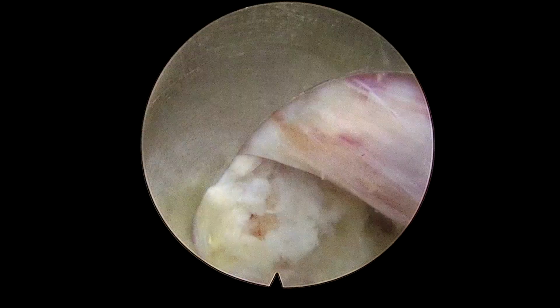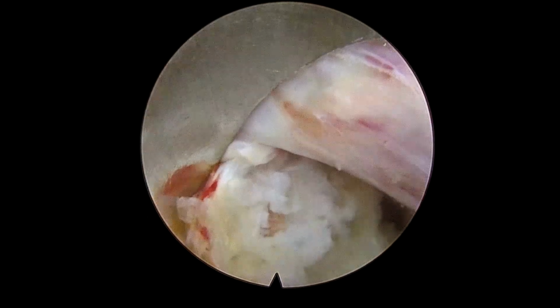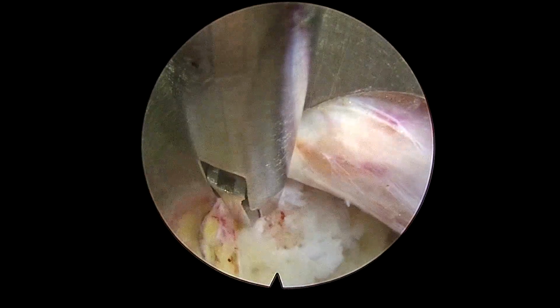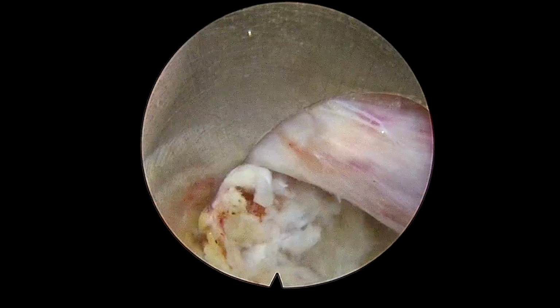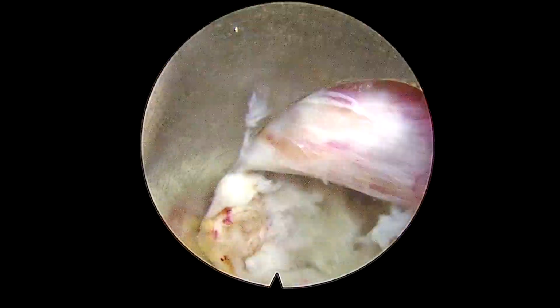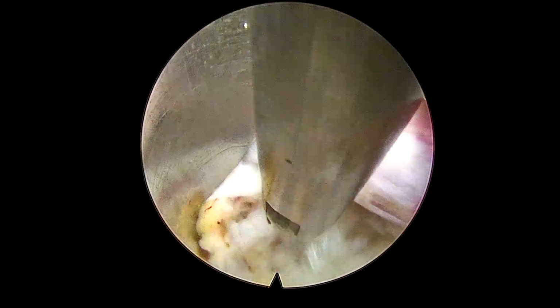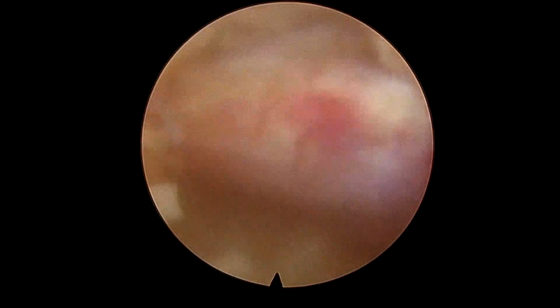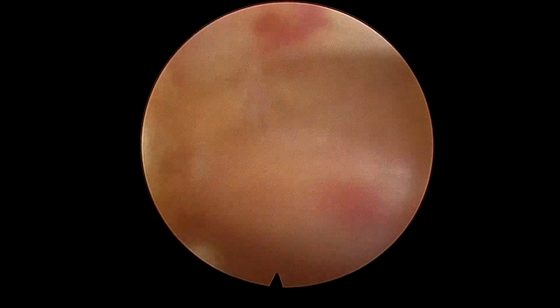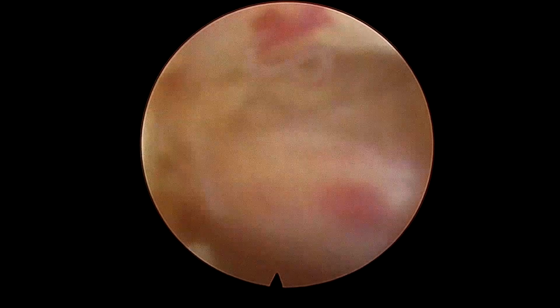Here there is some hardened annulus which was lying there. So I'm just removing that annulus. This is a sort of final survey step where you have to see all the things, whether you have removed the disc, whether you have removed the annular hump, whether the root is decompressed completely or not. These are some steps which you have to follow once you complete your discectomy.